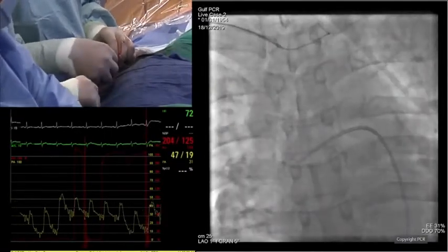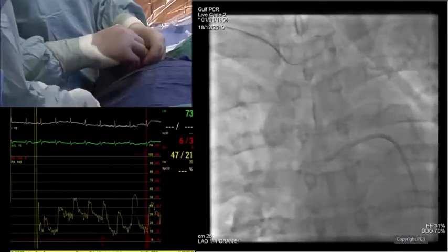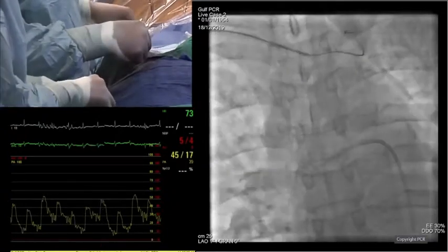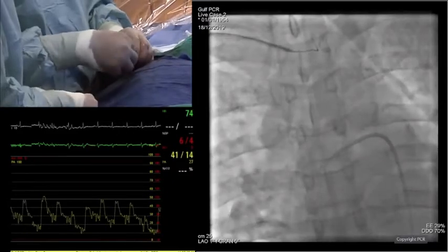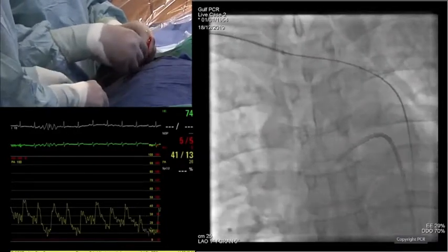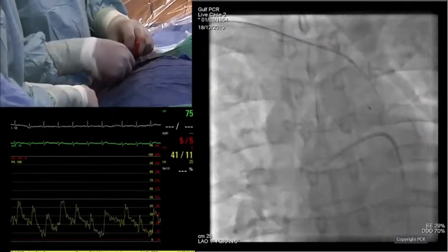No, I think first of all, I was again impressed by the use of the guide liner to pass the OCT. It was the case this morning, and it was really well done. And it's true that in this particular challenging situation with the tortuosity on the proximal segment plus calcification, the guide liner can give you the opportunity and can facilitate the crossing of the lesion by the OCT catheter.